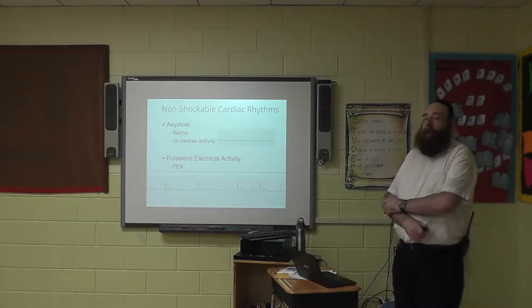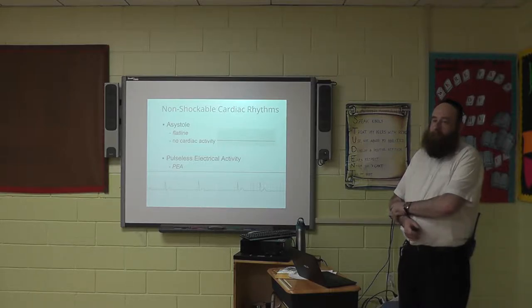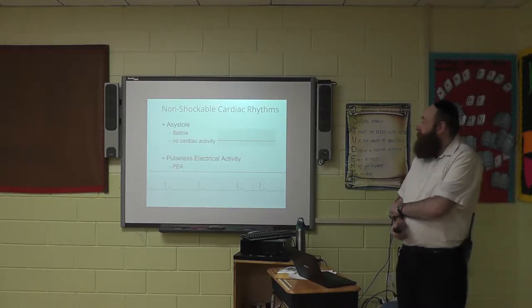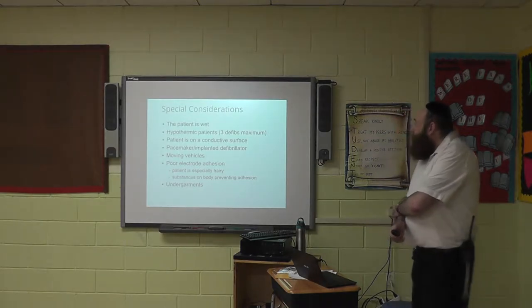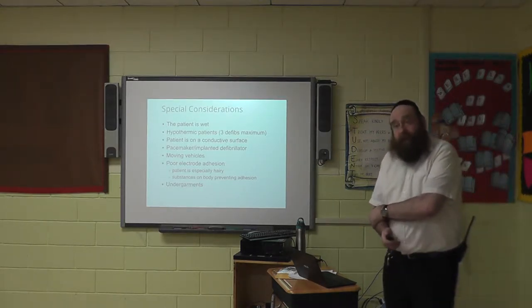But we're learning that you only check the pulse if there's a change in rhythm. There is a change. Every 2 minutes. You don't sit there compressing the patient for 20 minutes. You stop every 2 minutes and reassess. Check.